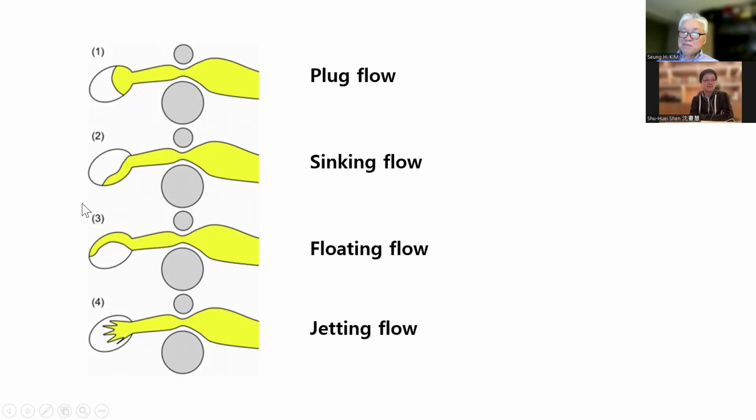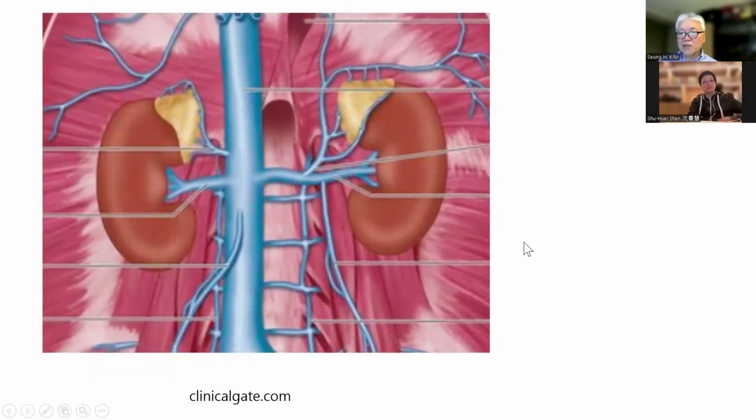If pattern 3 or 4 flow pattern is there, then the machine can make a warning to the clinicians that this patient might have Nutcracker phenomenon, and recommend that they review the patient's symptoms for Nutcracker syndrome. That is what we are doing now.